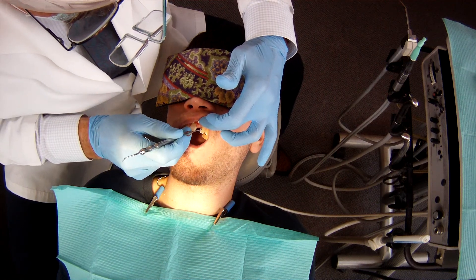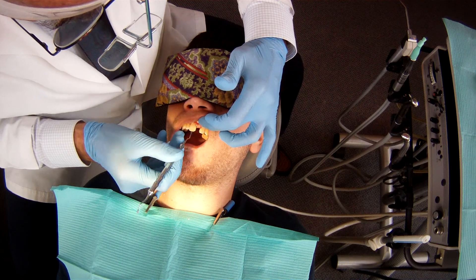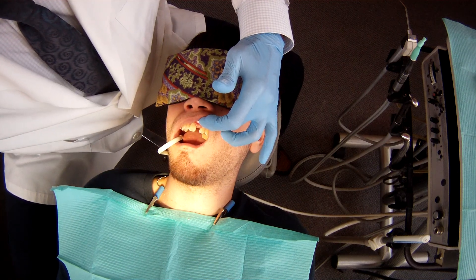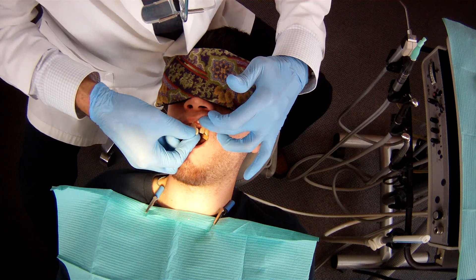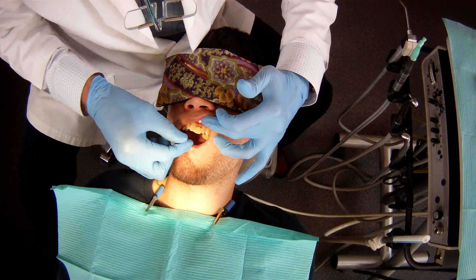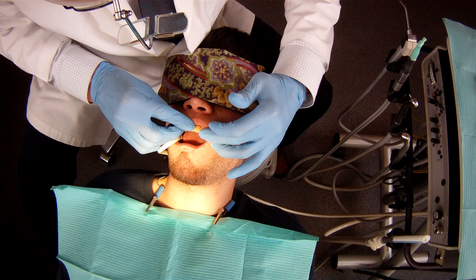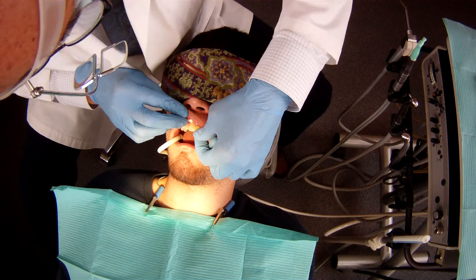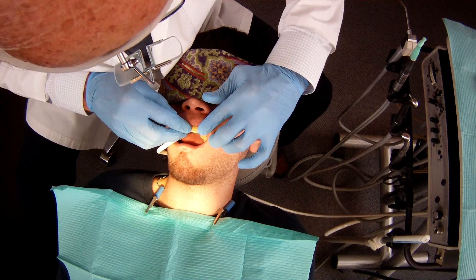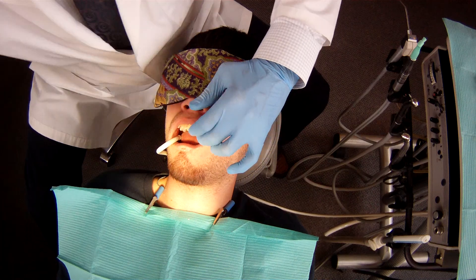You can feel this I'm sure. We haven't cut your teeth at all, so that's the great thing about it, isn't it? And then we will insert the pontic into that material and arrange it in such a fashion that it fits snugly to the gum tissue and to the support teeth.